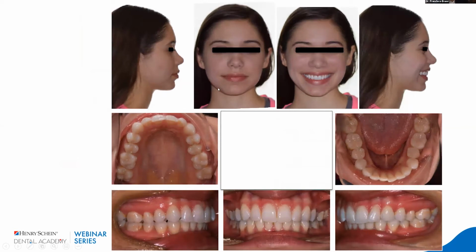This is a very young adult that came to the practice to correct a unilateral problem. The patient is not concerned about that, but the patient feels like she is not biting okay. However, when we do the clinical examination, we see an asymmetric class 2 malocclusion, right class 2, left class 1, okay? Midline discrepancy, crowding top and bottom.